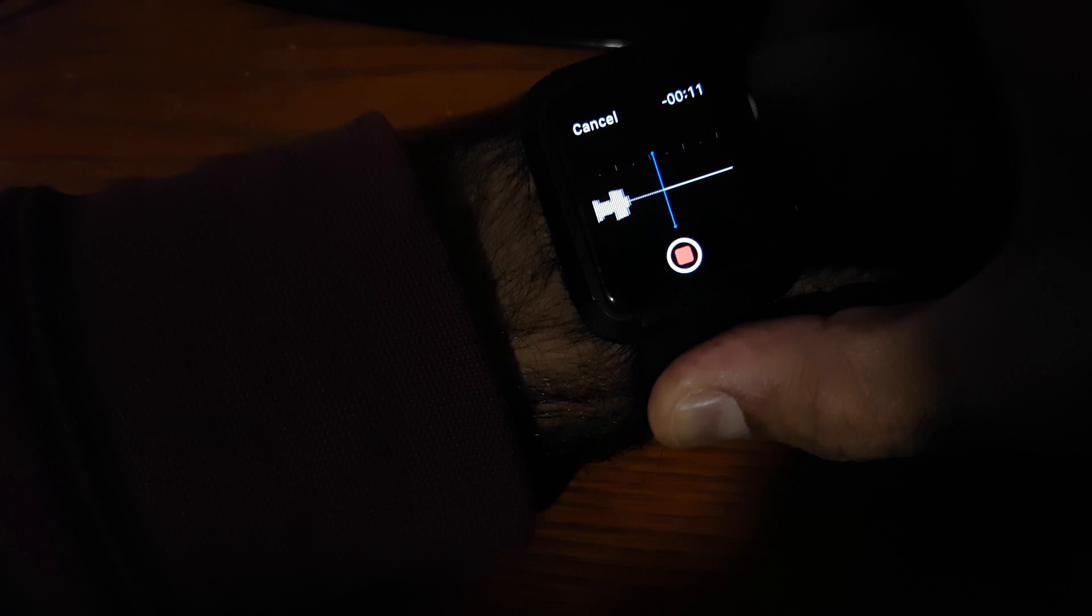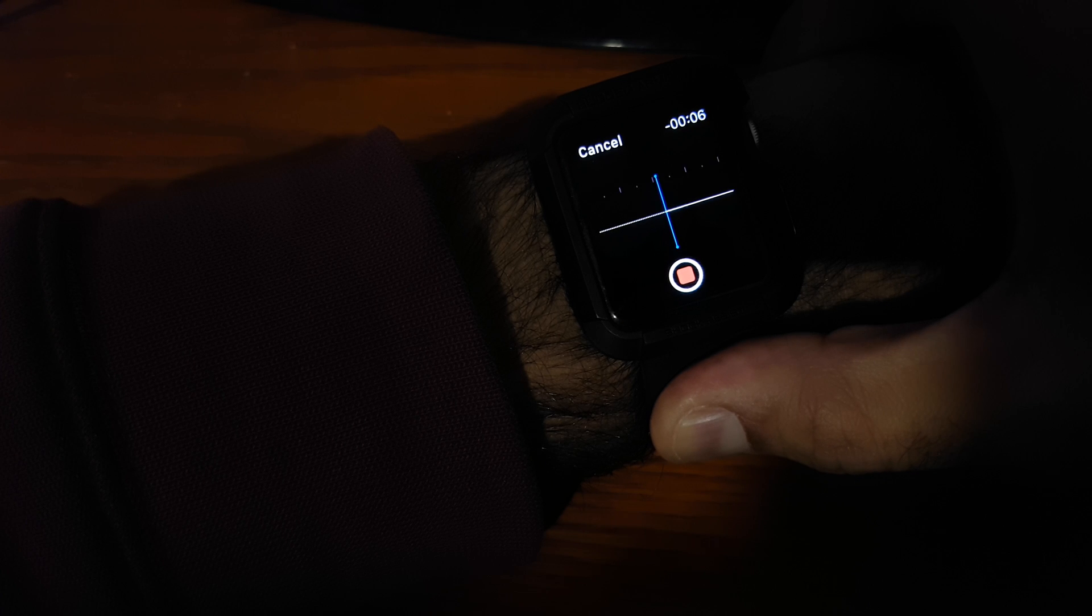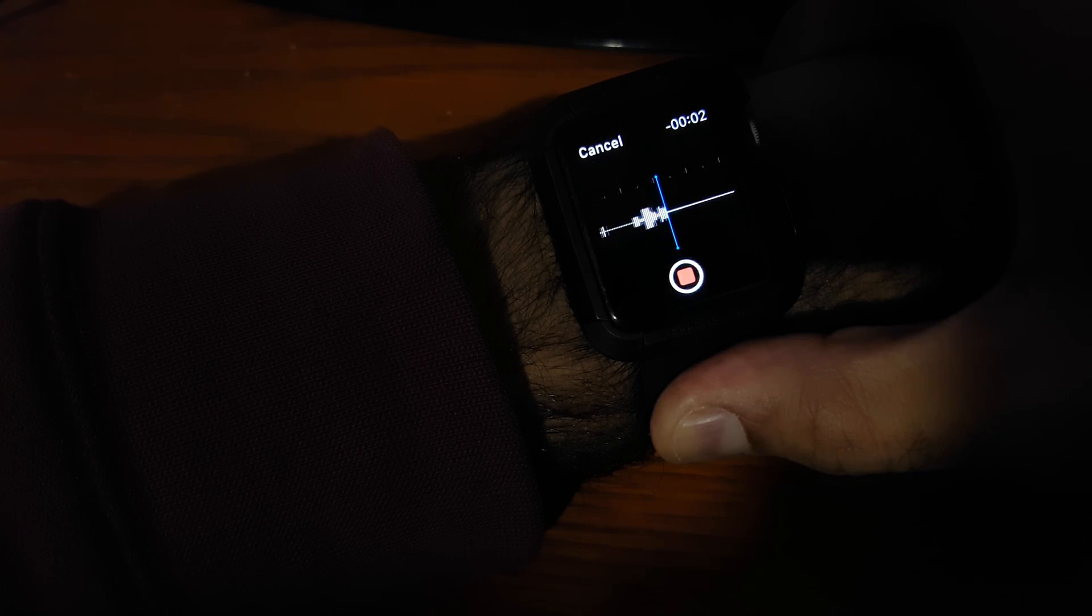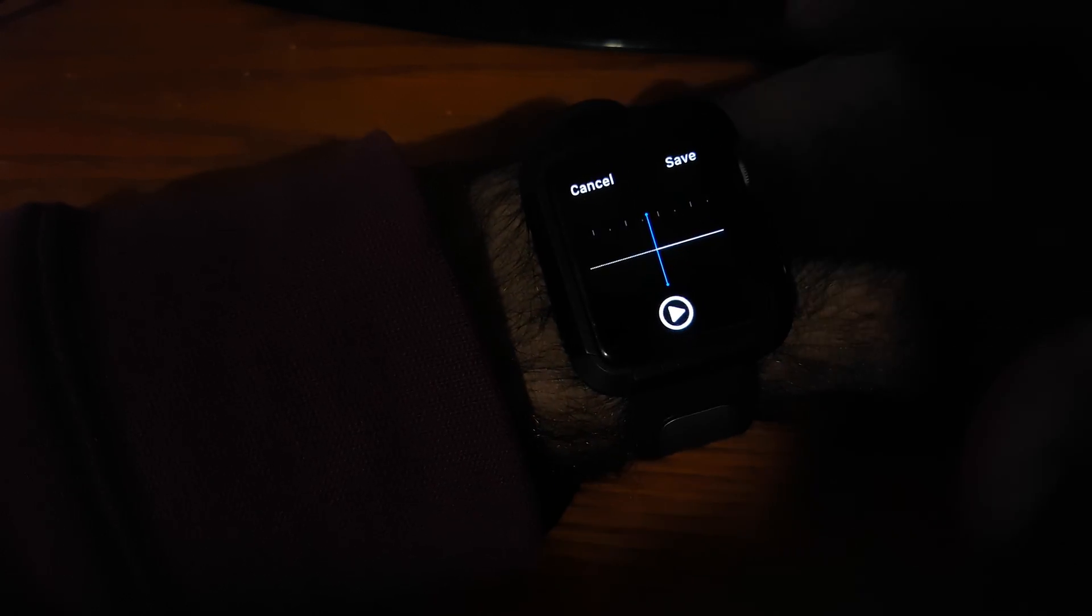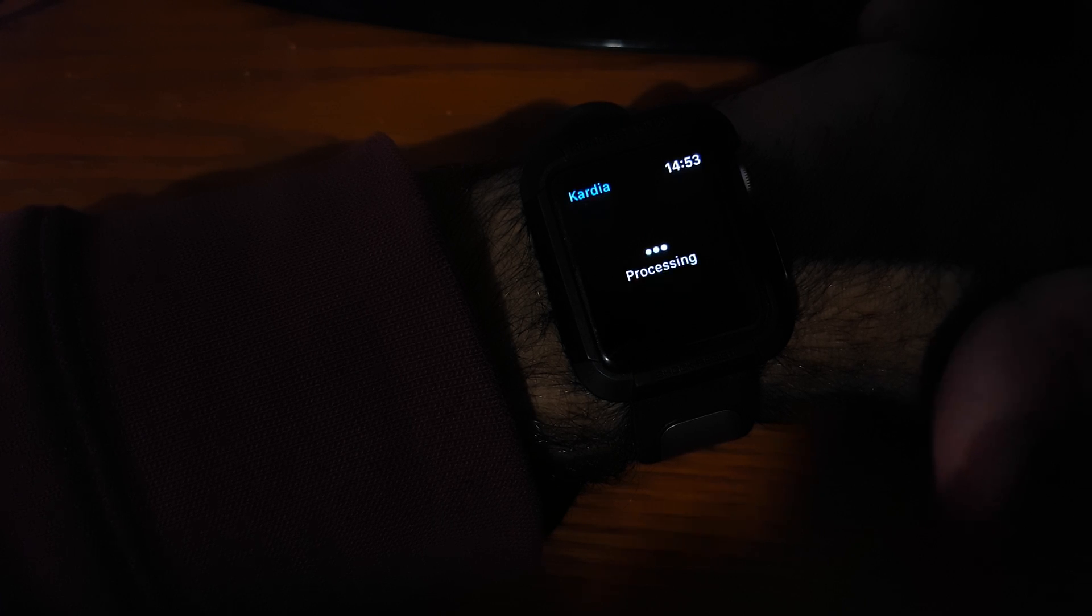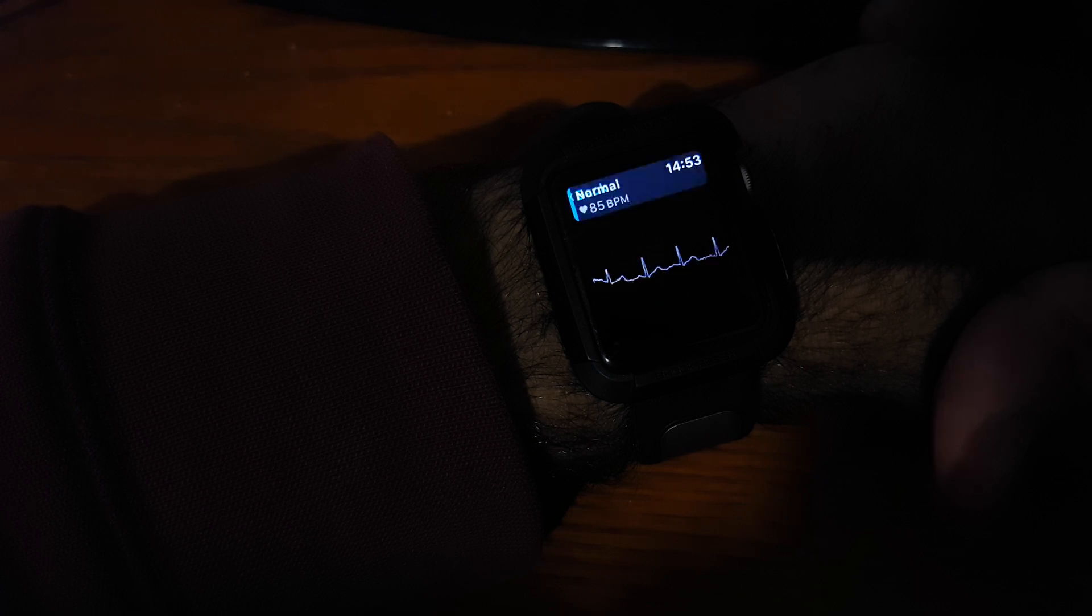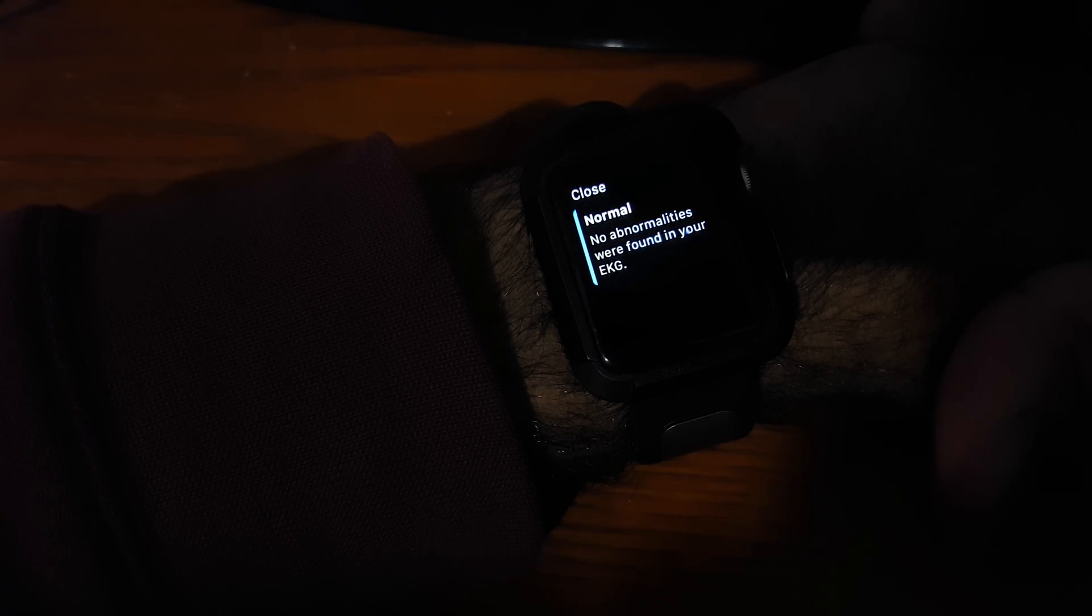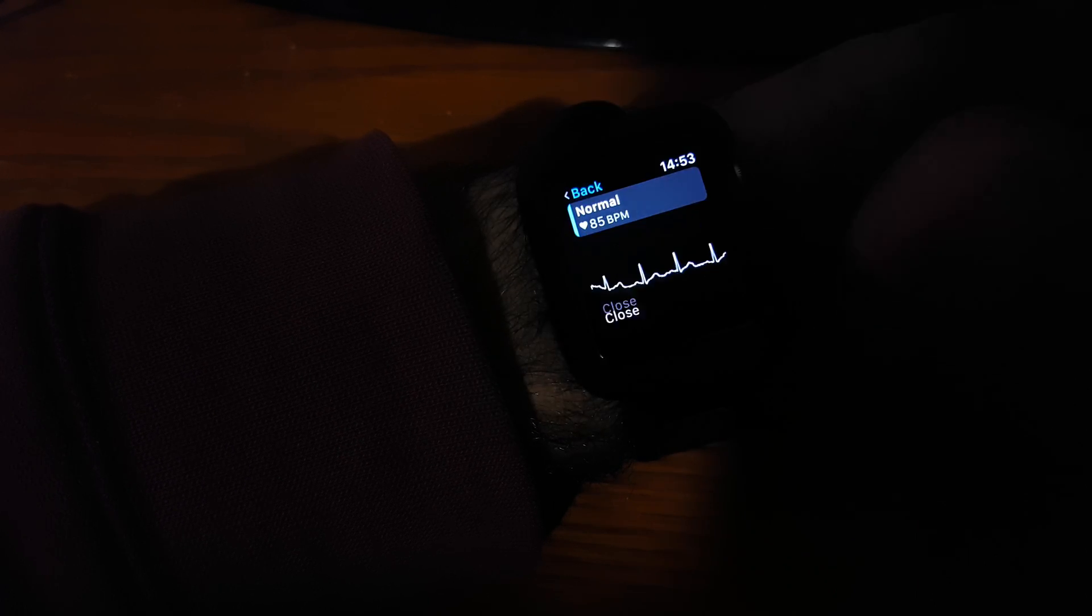Again, just holding that there with my forearms flat on the desk. And that should finish in a few seconds. Let's see what it says. So now if I just click save, it's now saving it. Okay, no abnormalities were found in your EKG, which is good news.